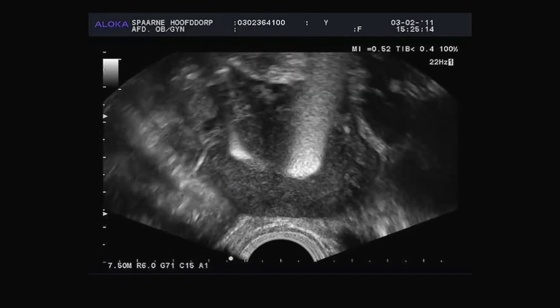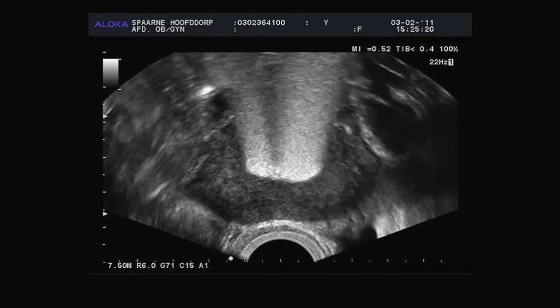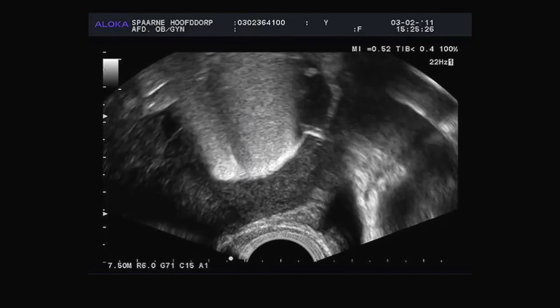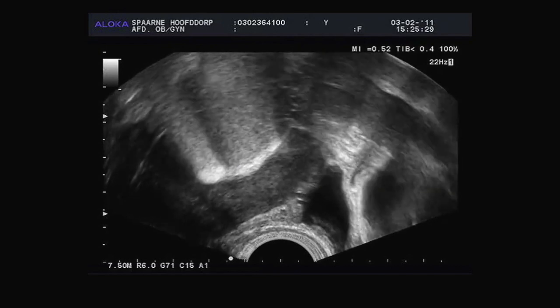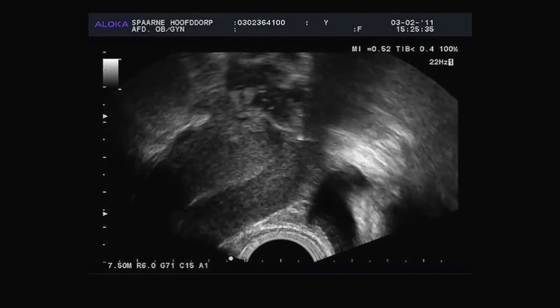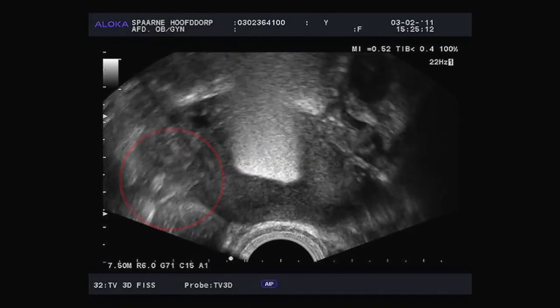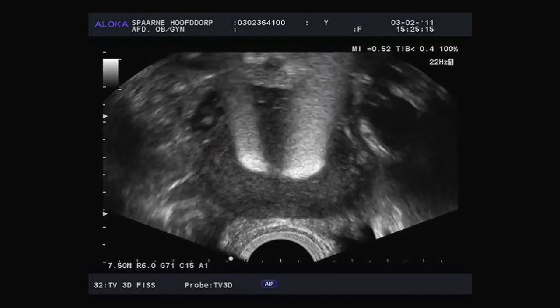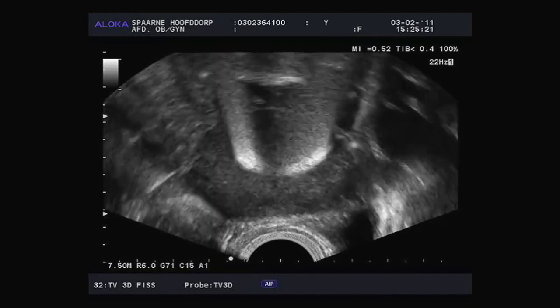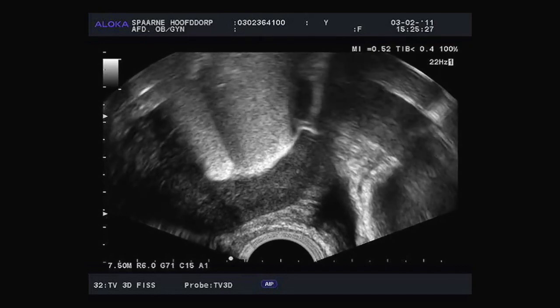There's a great deal of peristalsis, a lot of movement around it, which can sometimes make the ultrasound difficult. The fallopian tube turns with a sharp twist and then back again. It turns straight as it comes back from the womb to continue behind the womb. Here is a cross-sectional image. You can see how nice and thin the fallopian tube. Now we'll look at the other side first — see how the fallopian tube makes an enormous bend, but that's also clear to see. Behind the womb, there's a very nice thin winding fallopian tube.